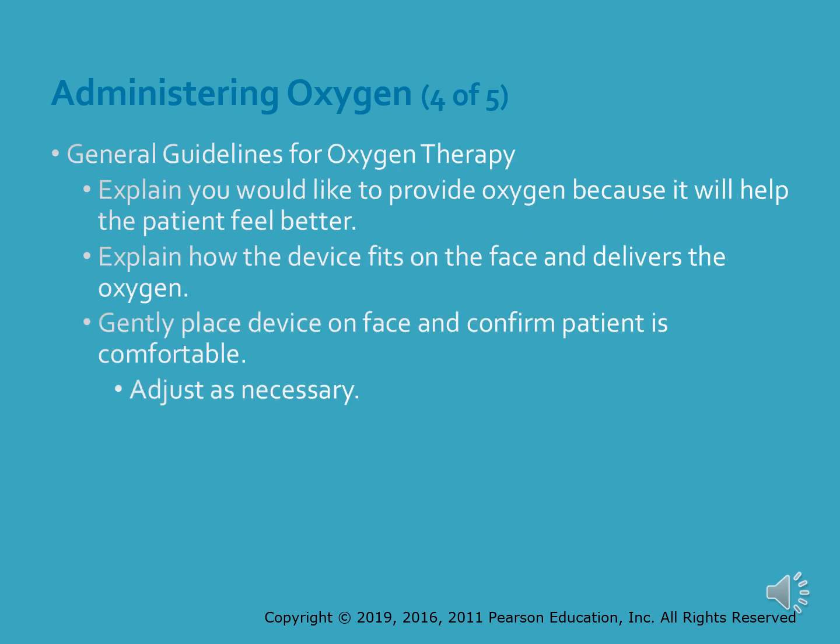Many patients may benefit from supplemental oxygen. However, there are some patients where too much oxygen may be harmful. Be sure to consult with your local protocols to confirm the standard of care for providing oxygen in your system, area, or region. Examples of situations where a patient may benefit from supplemental oxygen include cardiac arrest during the resuscitation process, respiratory distress, heart attack depending on the oxygen saturation, shock, and allergic reaction.